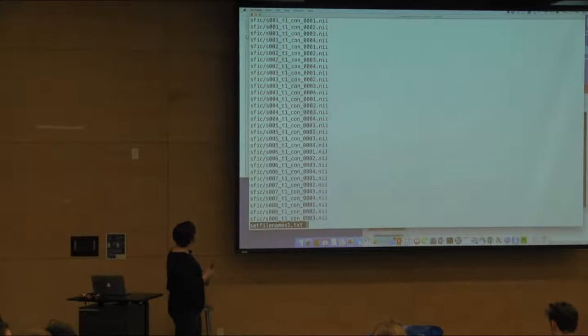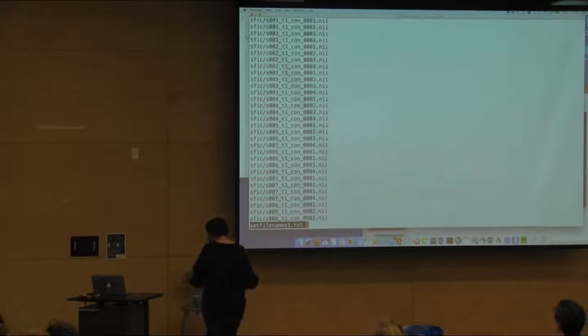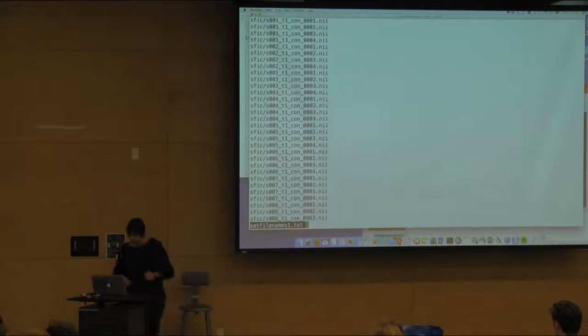So we have different time points, different subjects, and here 4 contrasts, 1, 2, 3, 4, which are different combinations of this domain. I forget the other contrast. But they mean specific things. So what you would be doing then is you would read in some specific contrast and you would do some computation on that and compare maybe the longitudinal forms of change or test some hypothesis about an interaction or something of that sort using data that had been already processed at the first level with your favorite software package.